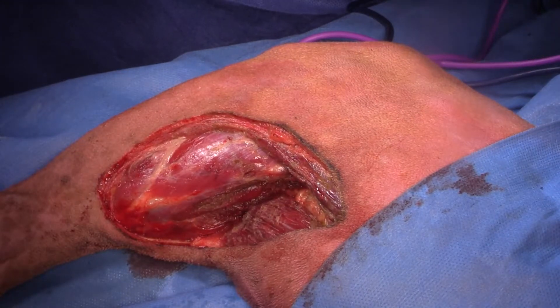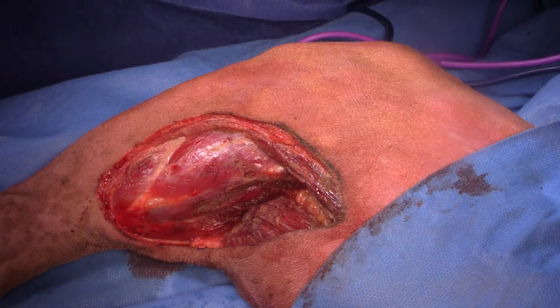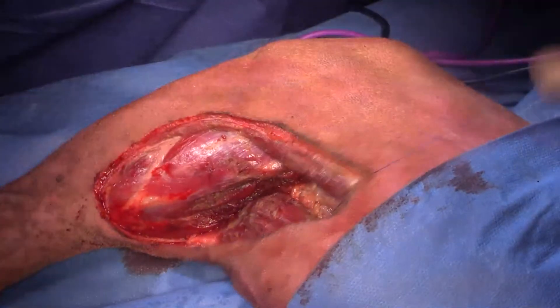Unrelated question — in cats that need a mastectomy, do you prefer a staged approach? So I like to stage my radical mastectomies. Close that muscle fascia like that, and then just an intradermal.